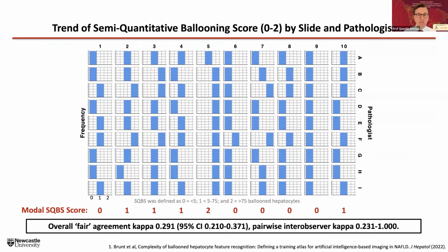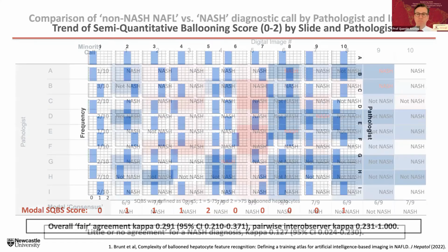But if you look at certain of the slides, there was still substantial variation. A great example here would be if you look at slide 7, running vertically there, you can see that for slide 7, 2 pathologists considered there to be a very large number of balloon cells, enough to get a semi-quantitative score of 2, whereas another 4 of the expert pathologists considered there to be absolutely no balloon cells present. And it's not just that one image, the same sort of variation could be seen in several of the others. So there is definitely an issue here in terms of inter-observer variation and how it may be interpreted.